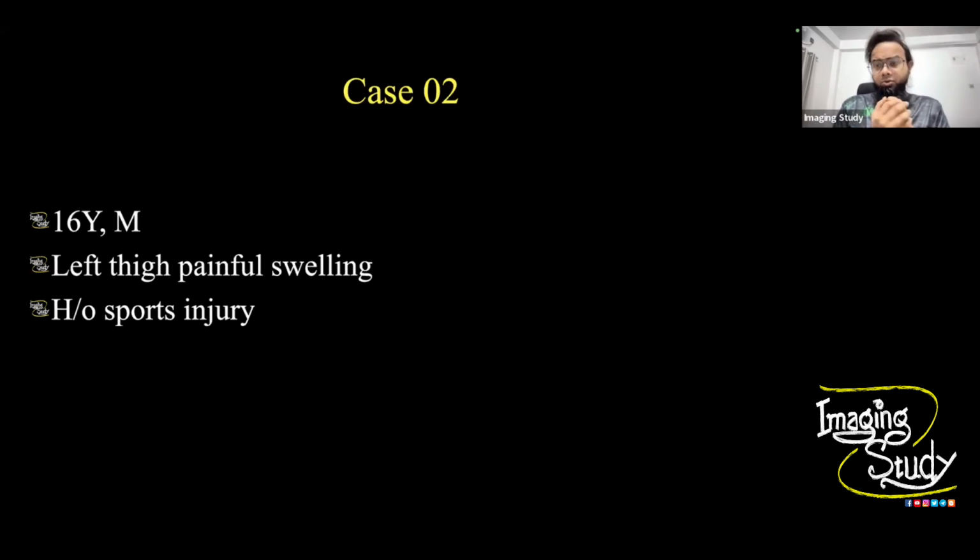This is a 16-year-old male patient, and he came with a left thigh painful swelling. There is a history of sports injury, like a football or cricket ball, which just hit his thigh, and there was pain and swelling, which is quite common. So the clinician sent us for evaluating the area. Let's see what we have got on ultrasound.